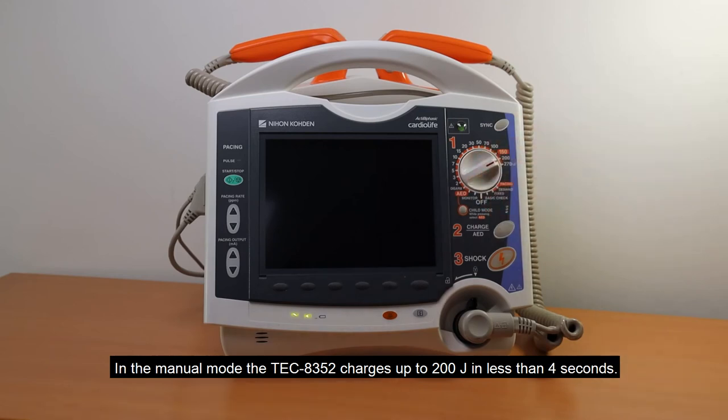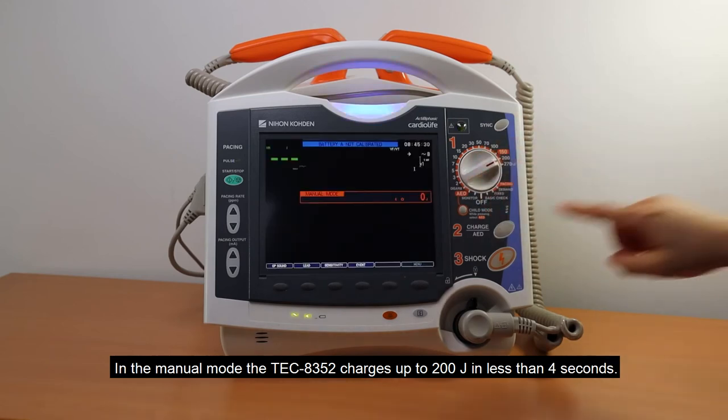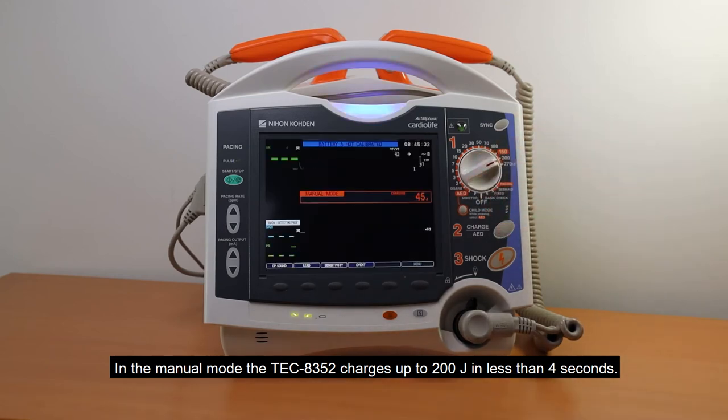In manual mode, the TEC 8352 charges up to 200 J in less than 4 seconds.